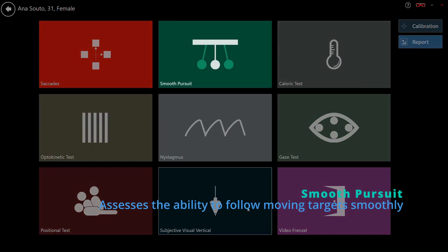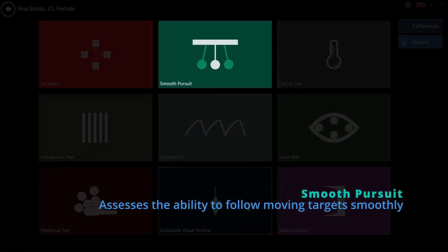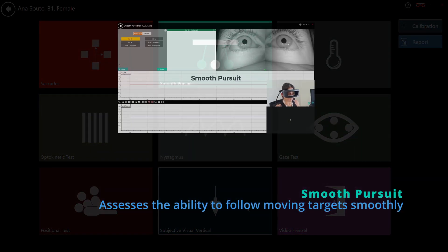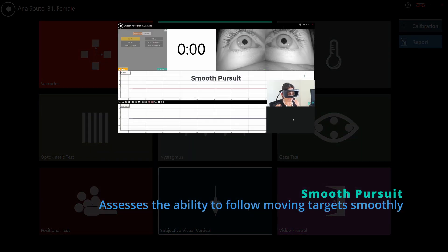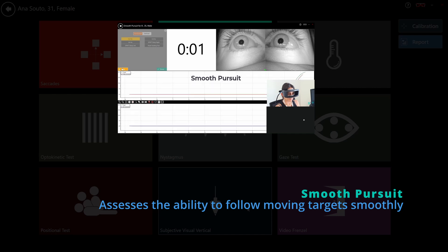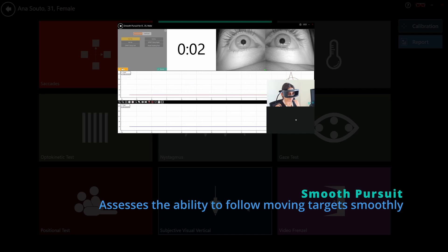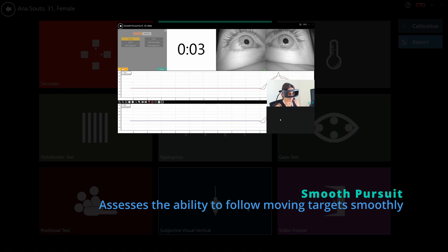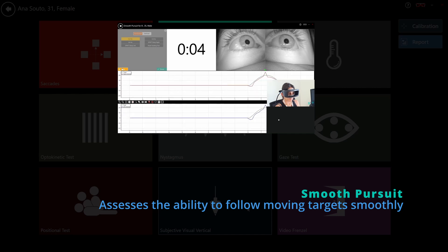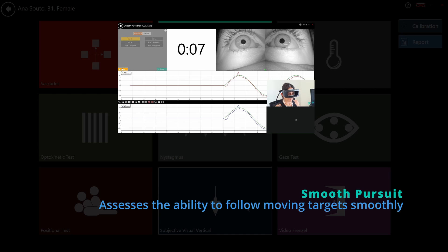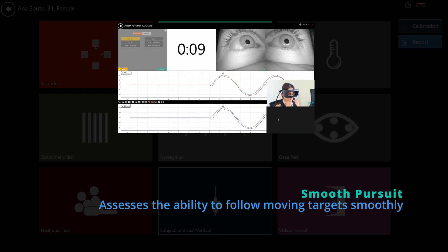Smooth Pursuit designed to evaluate the ability to track a moving target smoothly, this test analyzes forward and backward gain. It includes horizontal and vertical modes, as well as SPNTT and head tracking configurations.